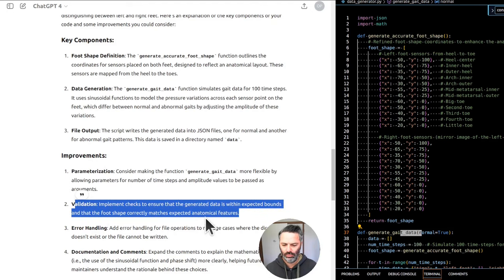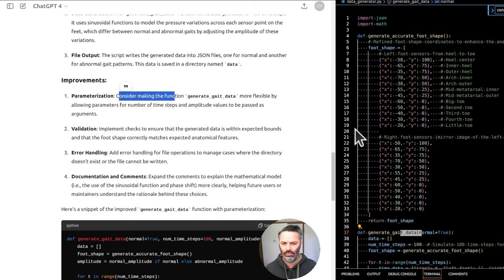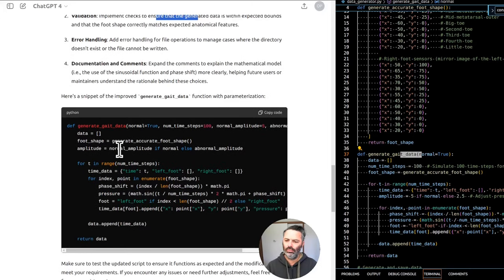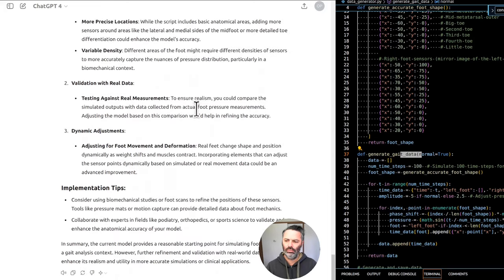Improvements. 1. Parameterization. Consider making the function generate gait data more flexible by allowing parameters for number of time steps and amplitude values to be passed as arguments. 2. Validation. Implement checks to ensure that the generated data is within expected bounds and that the foot shape correctly matches expected anatomical features. 3. Error handling. Add error handling for file operations to manage cases where the directory doesn't exist or the file cannot be written. 4. Documentation and comments. Expand the comments to explain the mathematical model.